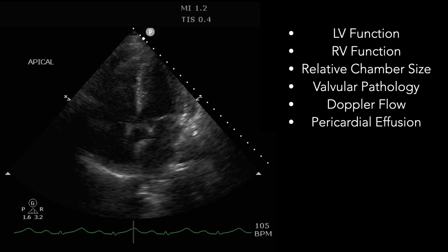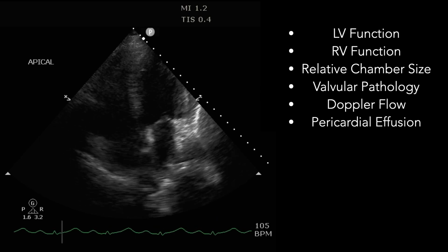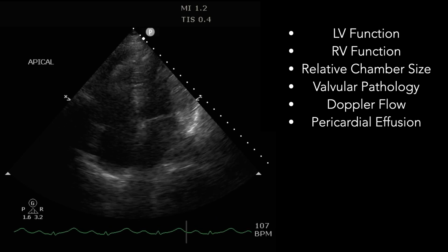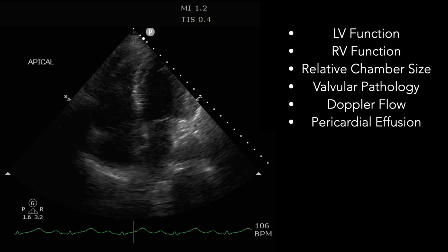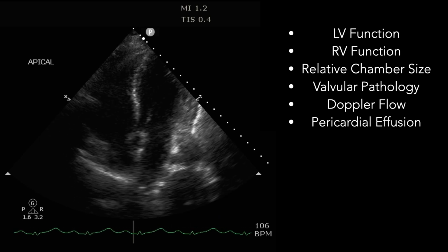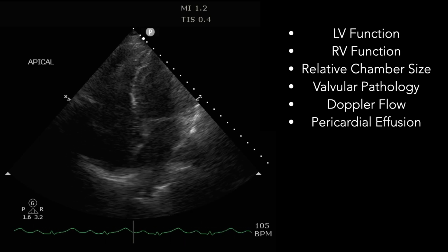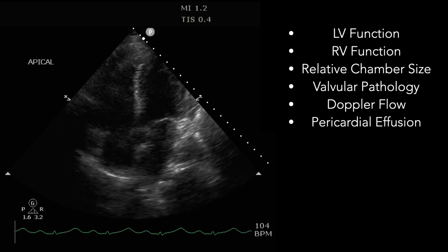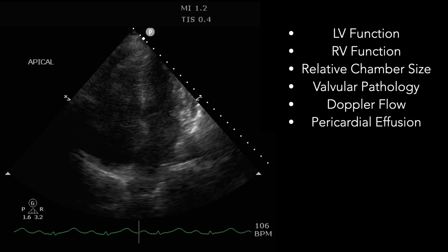And so the best way to accurately discern movement with ultrasound, with Doppler, is to align the beam of the ultrasound with the direction of flow. Now you can imagine if you're doing blood vessels, that's really hard because you don't have the probe inside the blood vessel. You usually have it perpendicular to the flow of the blood vessel. When you orient things with the heart, you're in the apical 4, the beam of the ultrasound is oriented in this window in the same direction as flow. Now the flow may be away from you or towards you. That doesn't really matter. It's going to show you the color, but it is oriented in the same general direction.